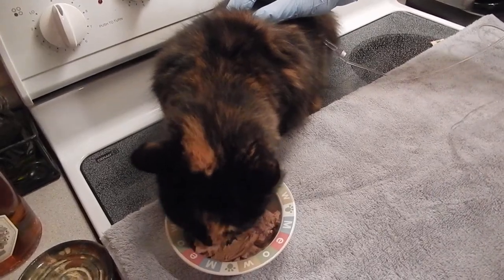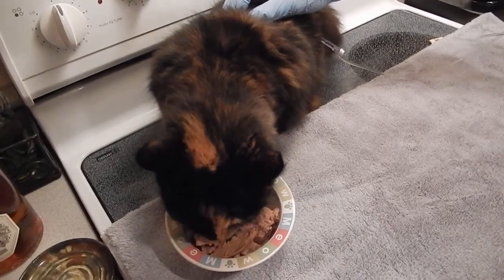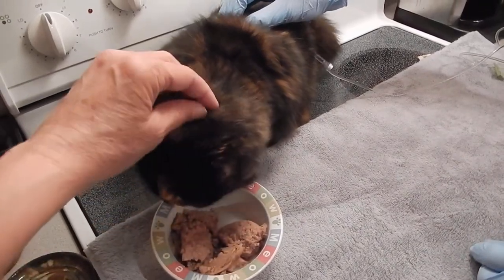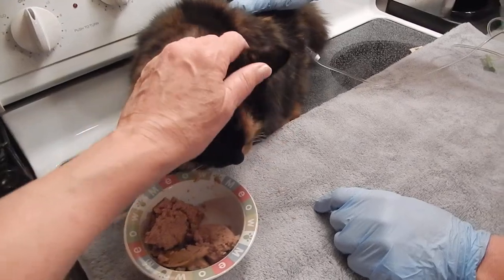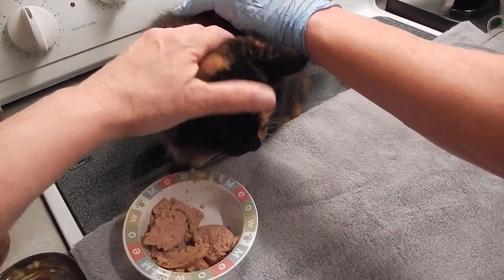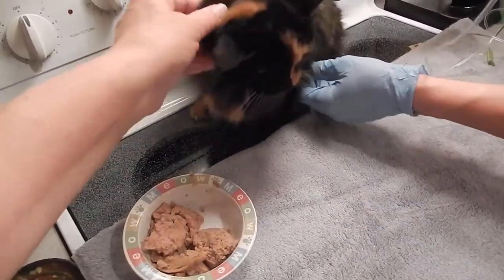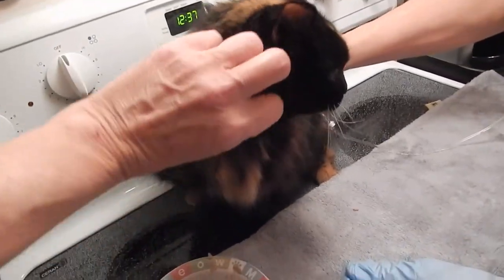And then we're just going to — slowly, like gravity, I can see the air bubbles. There you go. Good girl. It's okay, Fufu. You were good in the doctor's office. Yes.